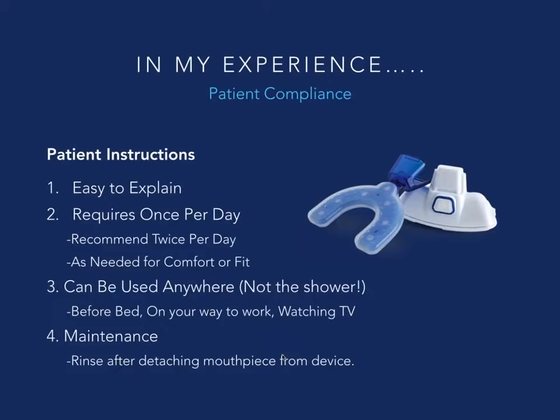We have learned from experience to not let the patients use it in the shower. So it sounds like a great idea, right? Brush and floss in the shower, save yourself time. Why not do the same thing with the vPro 5? Don't do the same thing with vPro 5. It will not survive, and you will need to buy a new one. So I would not recommend that.